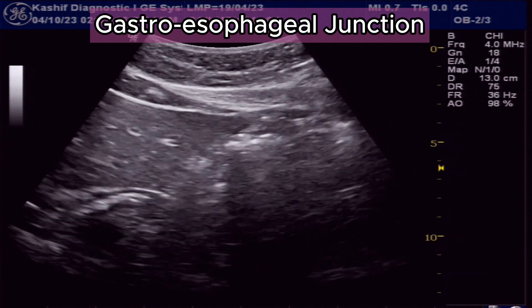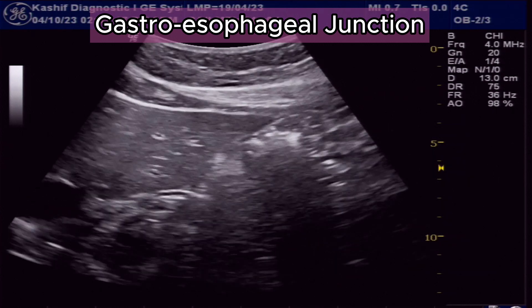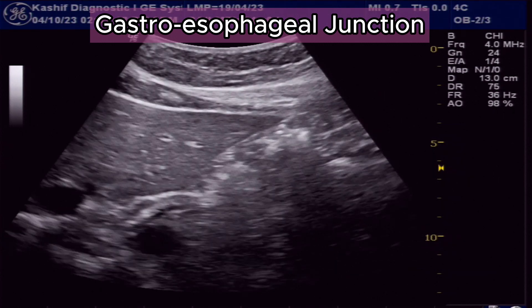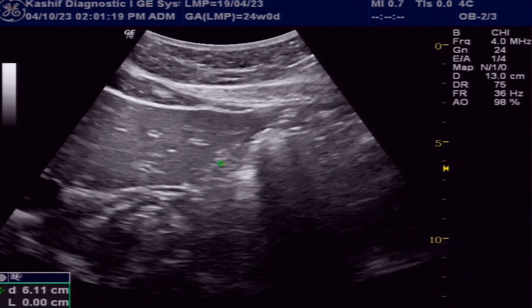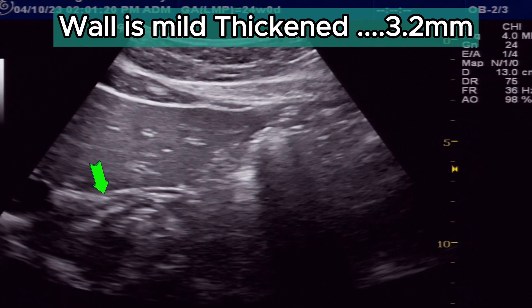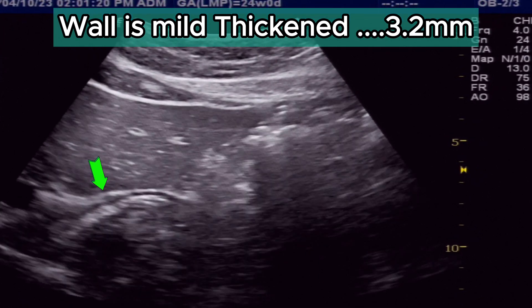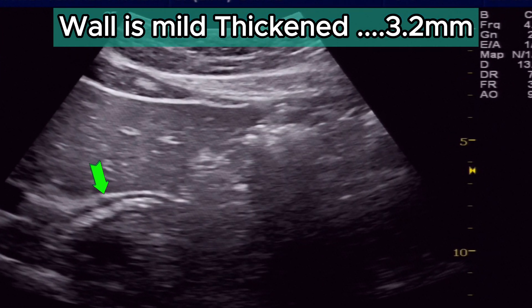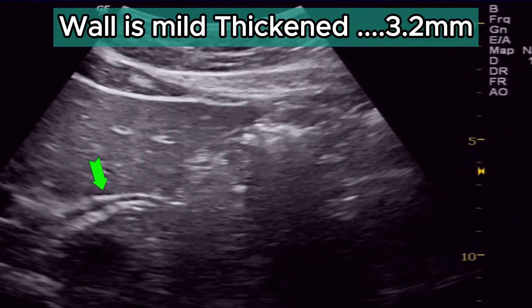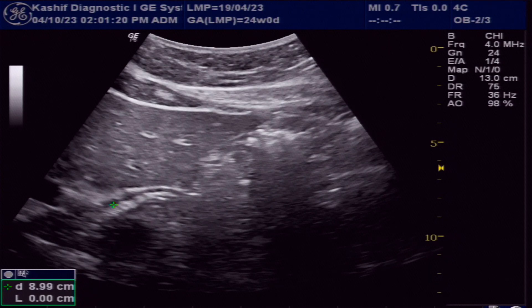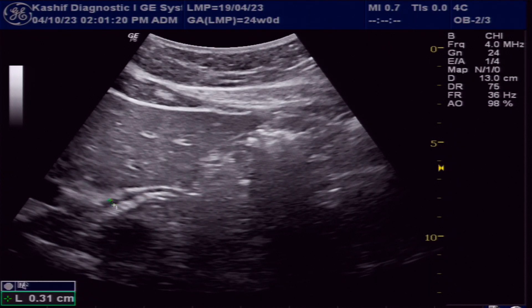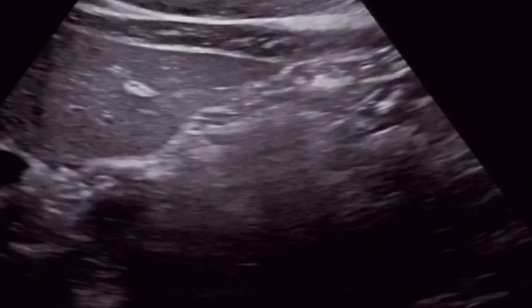In this case the gastroesophageal junction is clearly visualized. The wall is smooth and mildly thickened at 3.2 mm; normal is less than 3 mm. This shows mild inflammation.